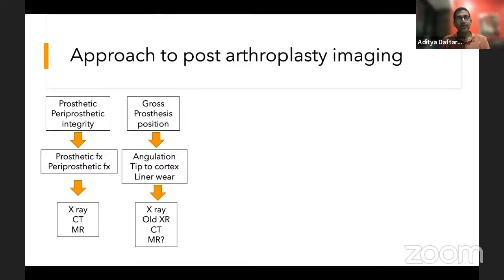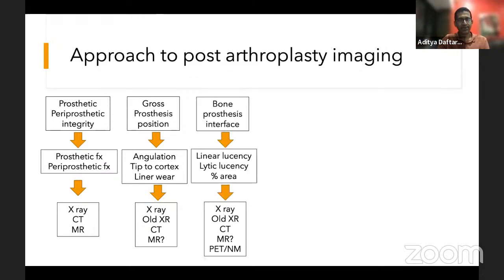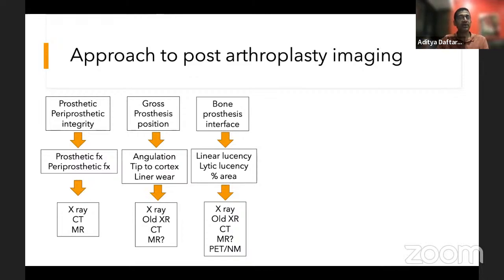I'll look at old images to check if the position has changed. X-rays and CTs are most important here. Next I look at the bone prosthesis interface, concerned about loosening, osteolysis, and membrane formation — there CT and MR are very helpful, as well as old X-rays. When infection becomes a concern, PET-CT or nuclear medicine studies become more important.